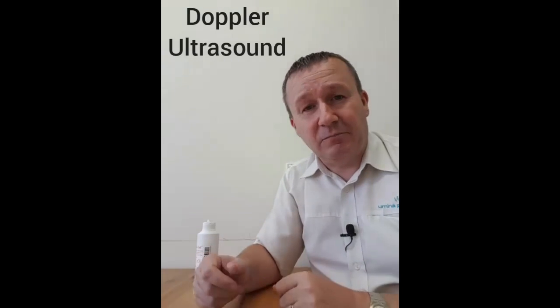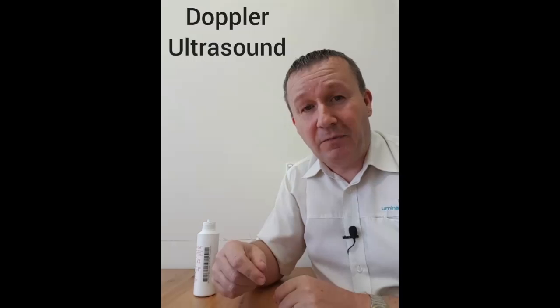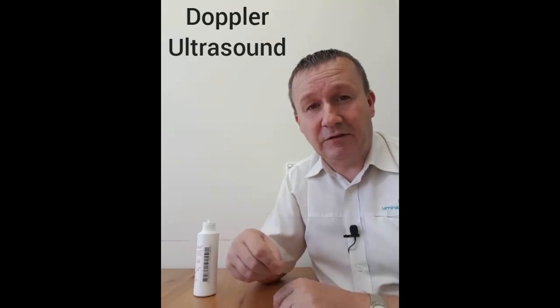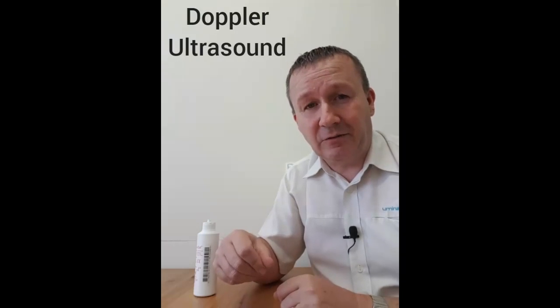It also gives us a printout and a digital readout of the quality of the blood flow in those blood vessels that we check. There are two main arteries in your feet — one behind your ankle and usually one on top of your foot — and we can have a listen to them while you're here to make sure the blood is flowing adequately. So that's our Doppler ultrasound that we use to check circulation in your feet.